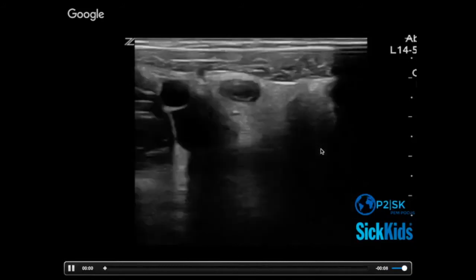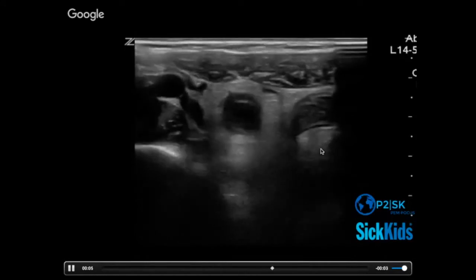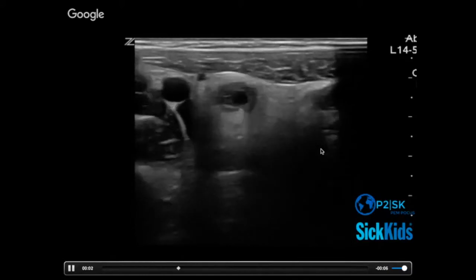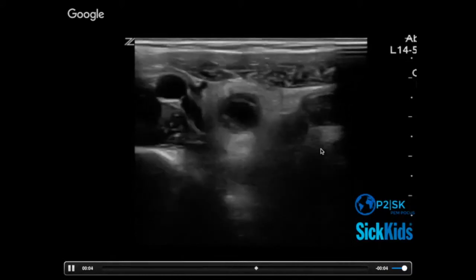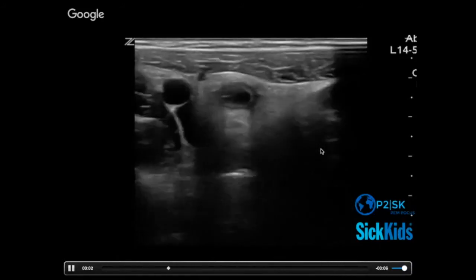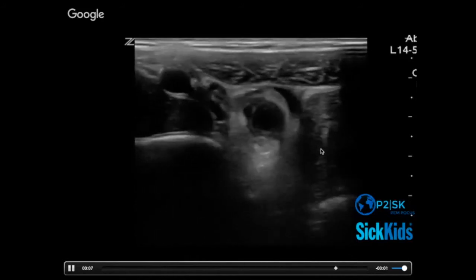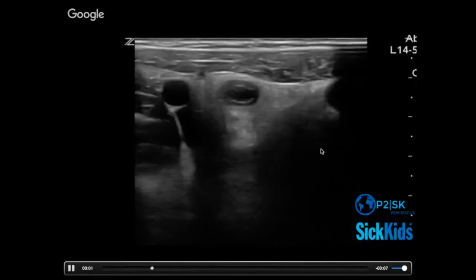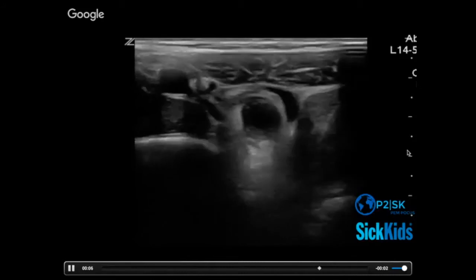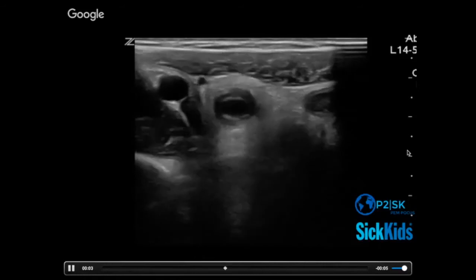Absolutely. And I think that, like wall hyperemia, the loss of the submucosal layer plays relatively little part in my overall determination of things like, is this appendicitis or is this patient perforated? I've seen some of the radiology images that they get, which are really nice, where they take it in a longitudinal axis and you can literally see the whole appendix like a finger, and then there's just that one little portion where it's missing the submucosa, and you're like, oh, I'm convinced that's a perforation there. But I think it's hard to get that. And you start doing more of the ultrasound looking and comparing the ultrasound findings to the patient.